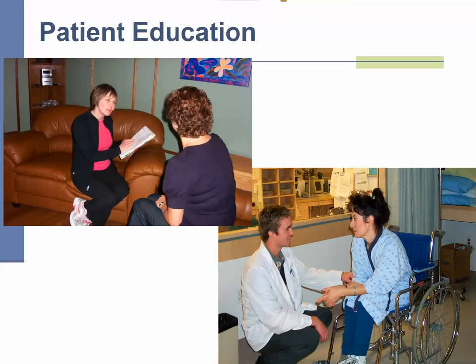We do patient education on treatment number 1, just to go over with the patient what the daily routine of radiation will look like. And also we review side effects and skincare and that kind of thing. Once the patient has started treatment, there is ongoing patient assessment and education that's carried out by the team on a daily basis. And in the event there's a concern that's arising from a side effect, we are in a good position where we can make any referrals to another healthcare provider to help assist in the management of those side effects, or in some of the psychosocial issues that a patient may be experiencing. So an example of those referrals would be to social work and to the dietary consultants.